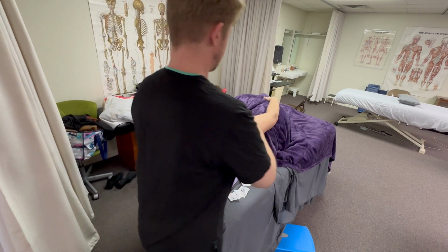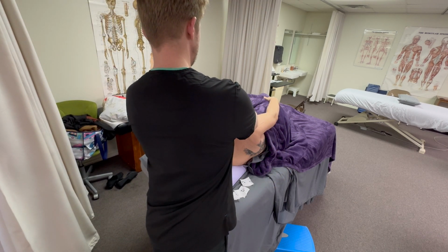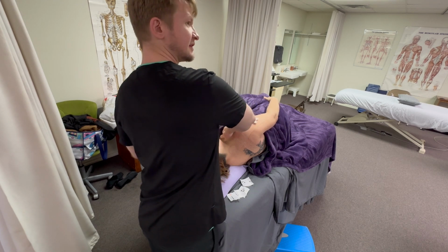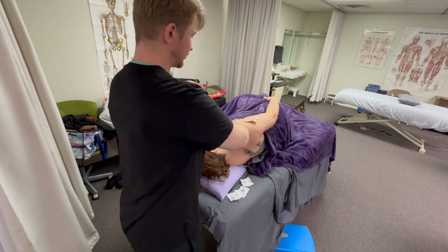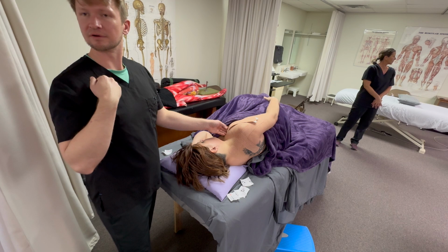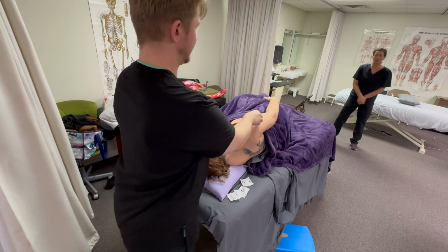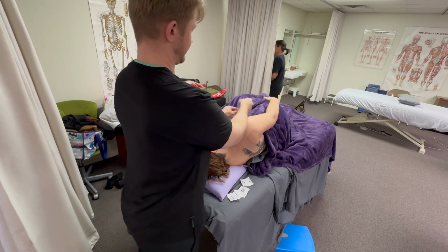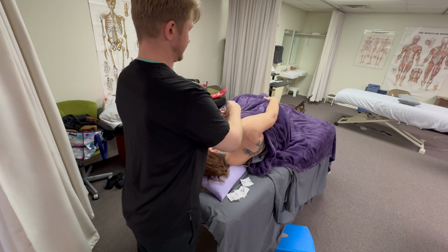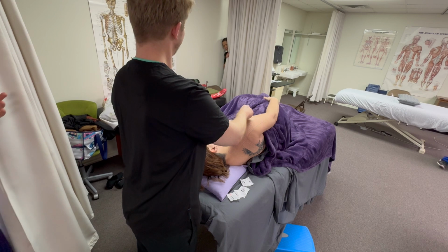Now, anchor on the skin. Here on the chest, it doesn't matter too much where. I'm just trying to get somewhere on the skin below the clavicle. Now, I'm going to go here. It's a good poke.